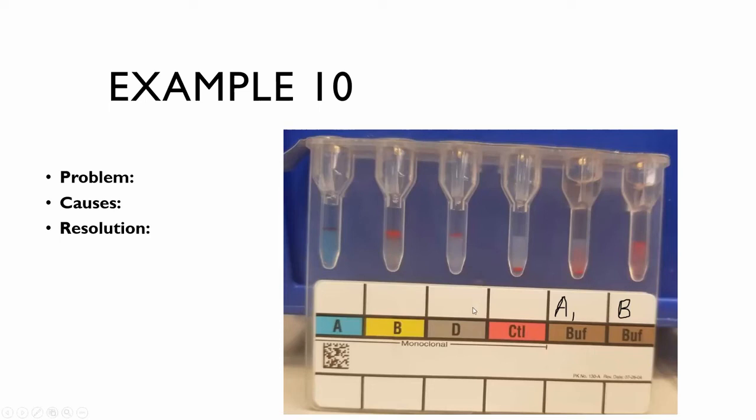Does that make sense? That means in your control, your cells are just agglutinating spontaneously. It's not because it's a true positive reaction with anti-A or anti-B. So you just have some extra reactions in your reverse typing, which could be caused by an AB patient being transfused with O plasma.